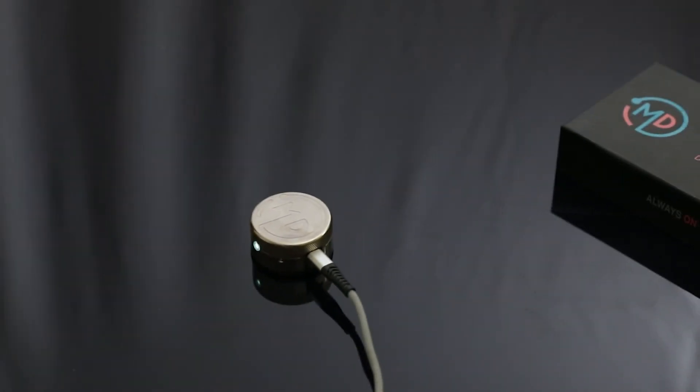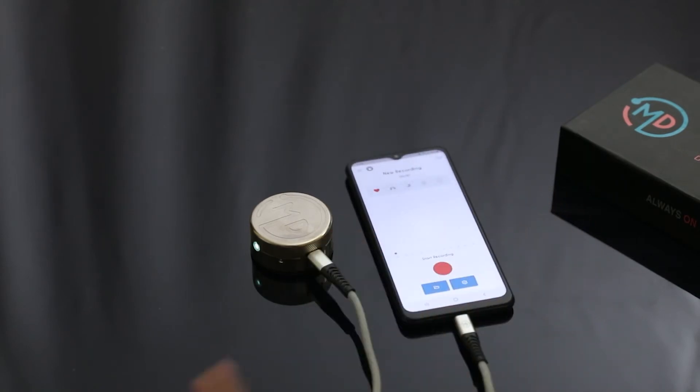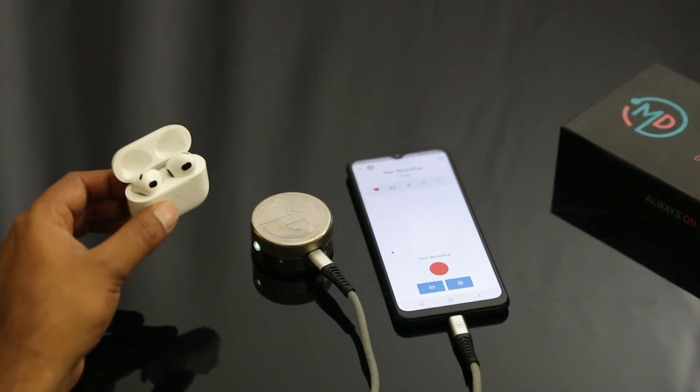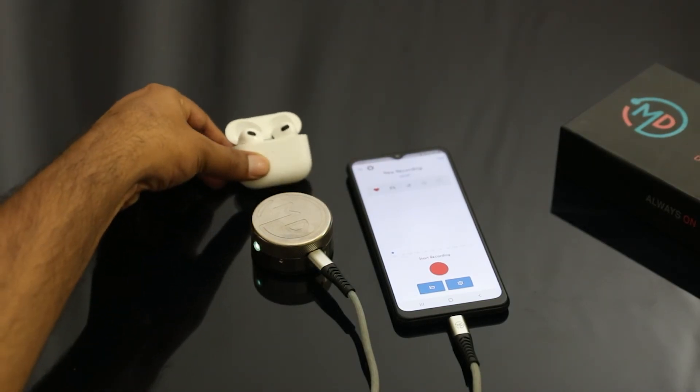To auscultate using Tal, take your mobile phone, download the Sur app, and connect the USB-C cable to the mobile phone. Then take your Bluetooth earphones and connect them to your mobile phone.